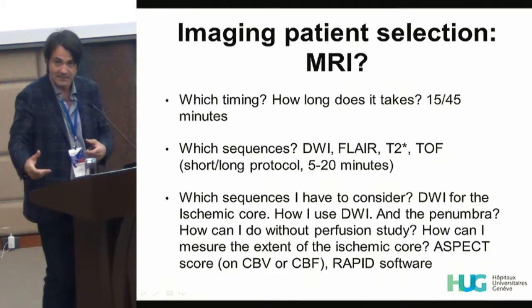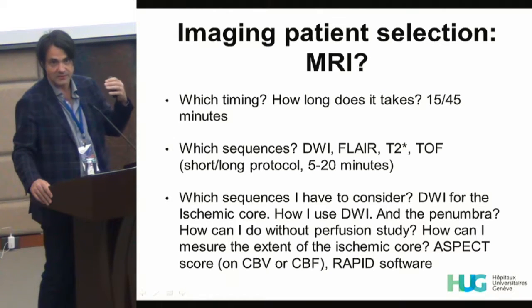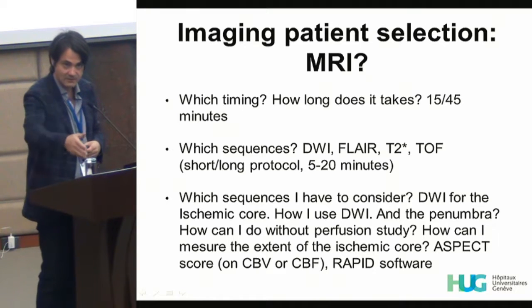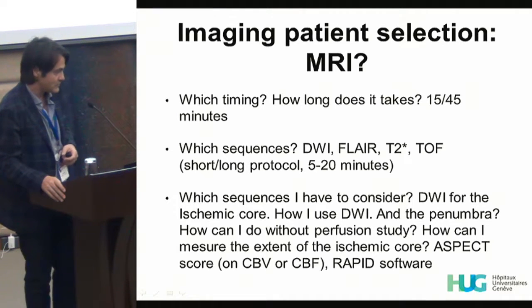Why? Because we have the habit with this. I've been working in France for 10 years, and they select patients with MR. If one day MR is not working, they select with CT, and for CT angio and CT perfusion, they spend 1 hour to perform it.